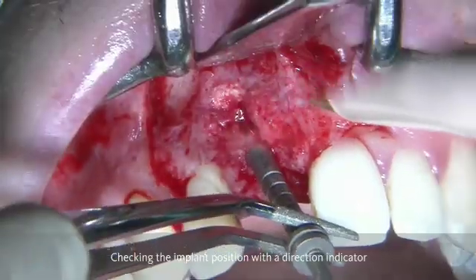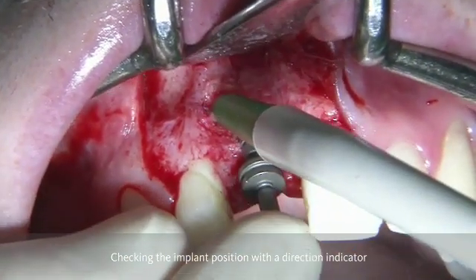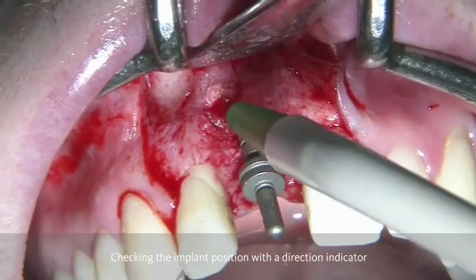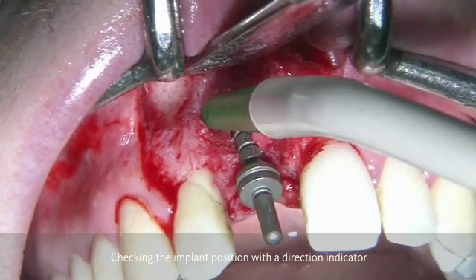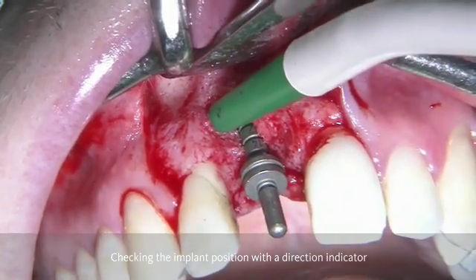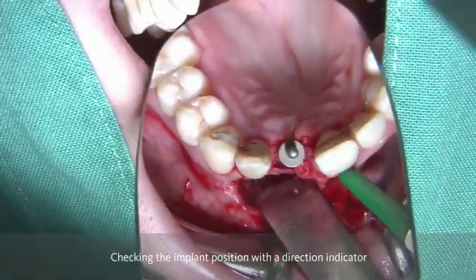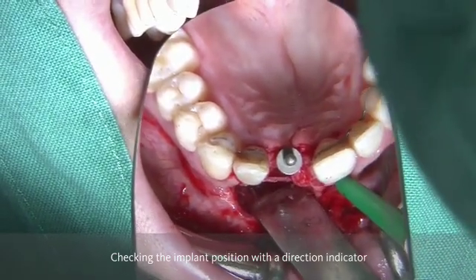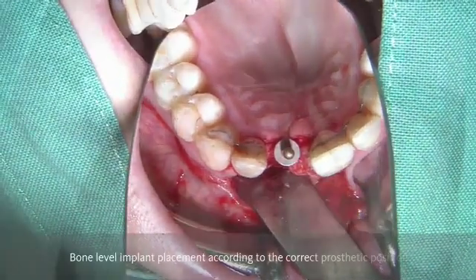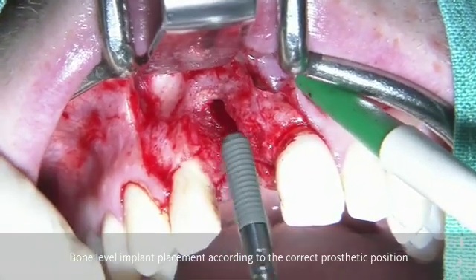After this drilling process, we always check the implant position by having a direction indicator to see whether we are correct from a mesiodistal point of view, from a vertical point of view, and a buccal point of view. The aim is to place an implant in such a position that we stay as far as possible from the buccal aspect, and being able to deliver a screw-retained reconstruction.